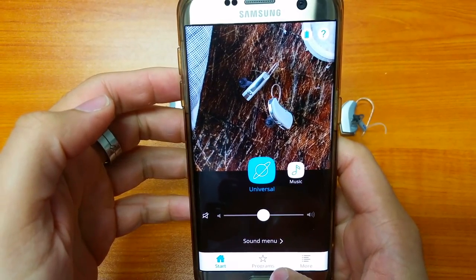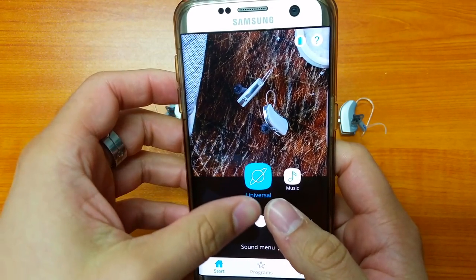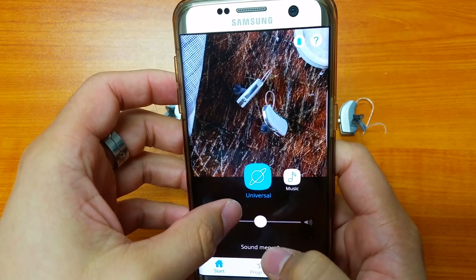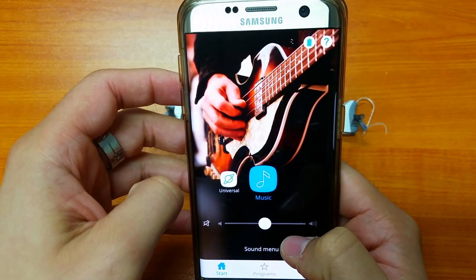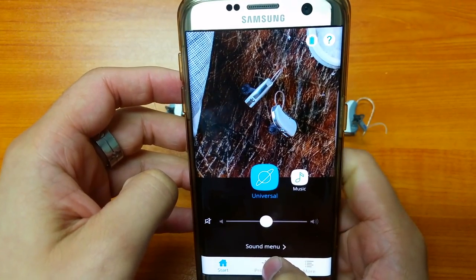Let's have a closer look at the app. Once the hearing aids are paired, we're greeted with the main screen. We've got two programs programmed into the hearing aid: a Universal and a Music mode. If you want to switch programs, hit Music and it switches over to that icon, and going back to Universal switches it back.